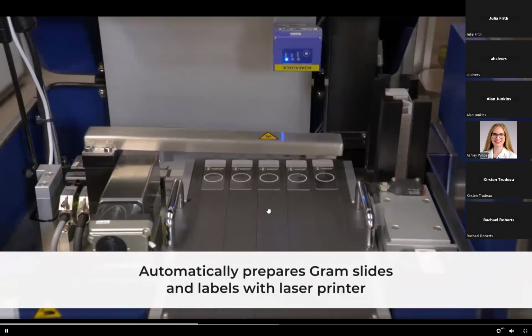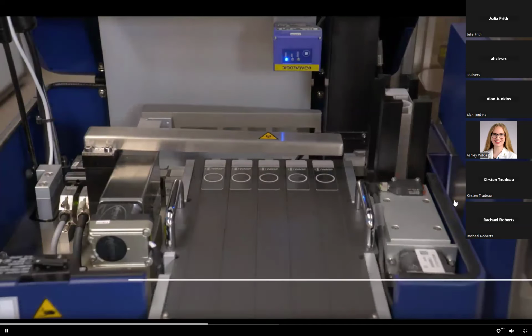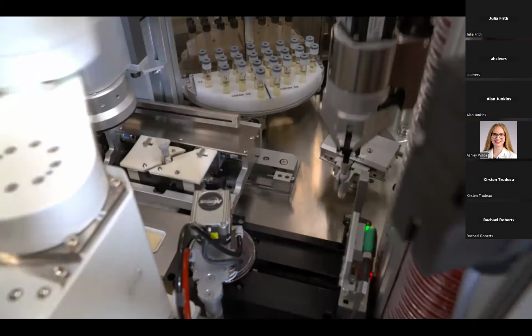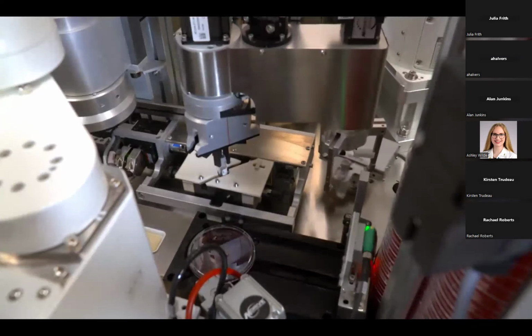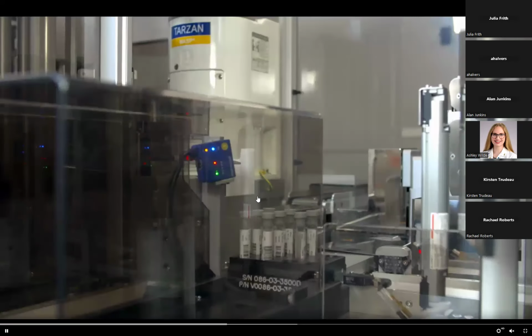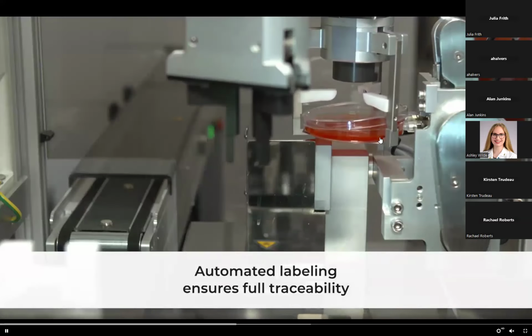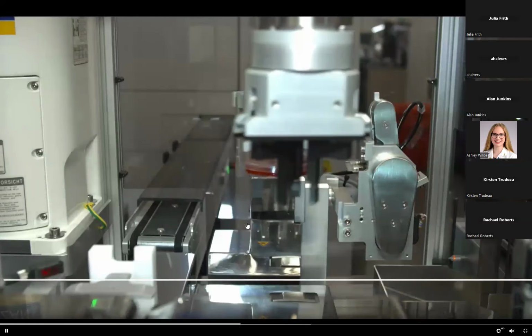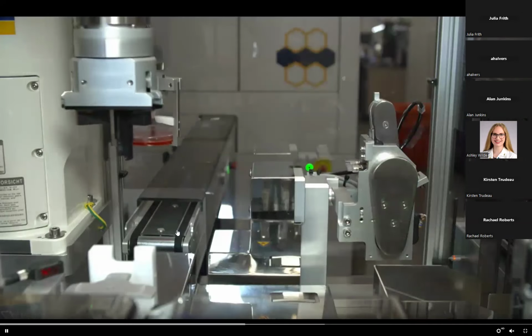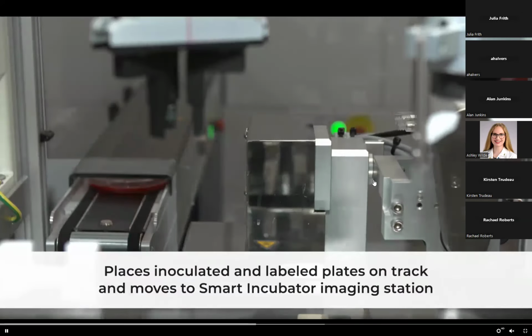Then, if it's a specimen that requires a gram stain, it will also make a slide. It's not going to stain the gram stain. You still got to do that yourself, but it will make the smear for it. Then that specimen's done. It's going to take it and put it back in the rack over here. Okay. The plate gets barcoded. It scans it to make sure it can read it, and then puts it on this conveyor belt. That takes off and goes down the line.